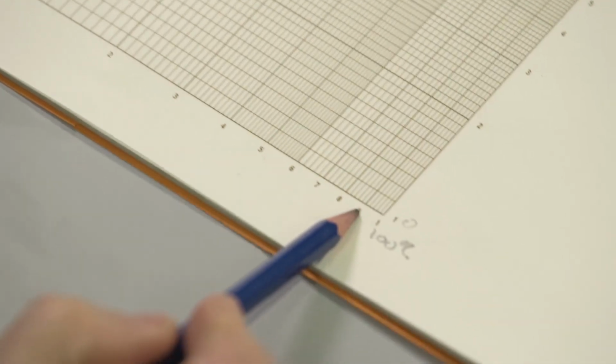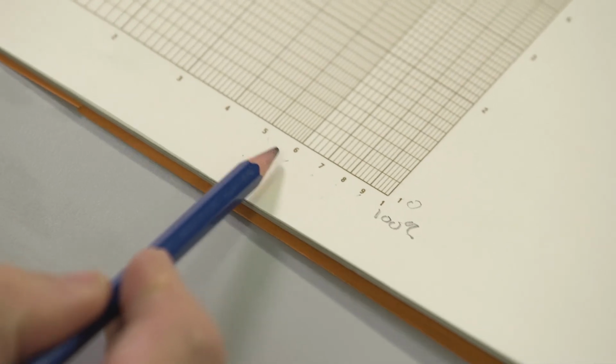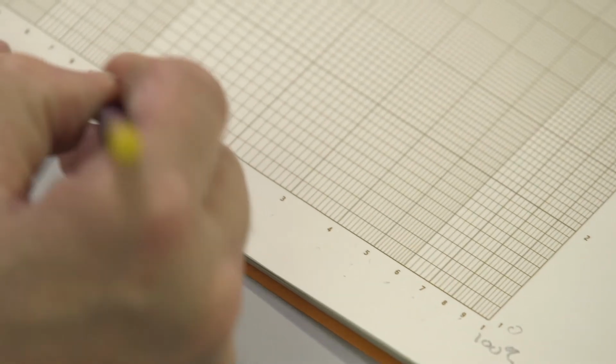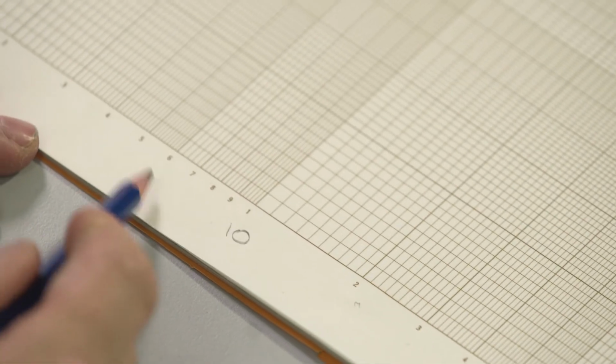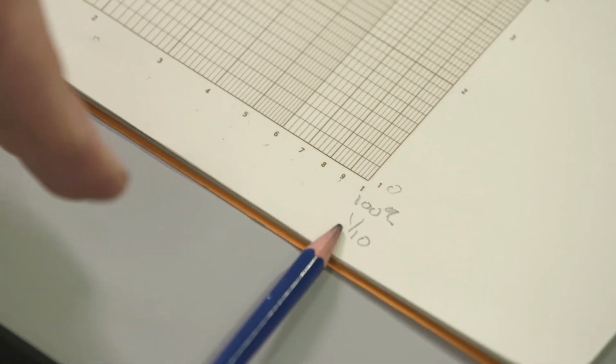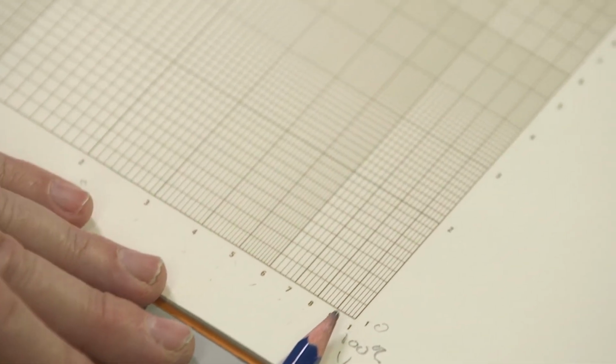Logarithmic scale. If this is 100%, 90, 80, 70, 60, 50, 40, 30, 20, 10%, 9, 8, 7, down to 1% for the purposes of plotting. First dilution, 1 in 10, which we're considering 100% for the purposes of plotting. So the clotting times we obtain for the 1 in 10 are on this location.